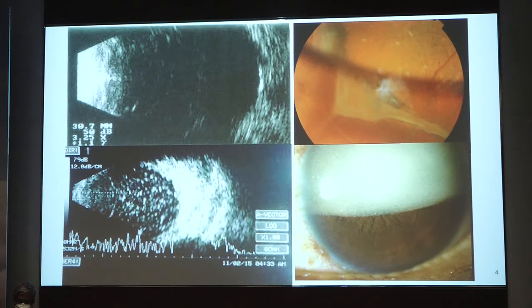Your patient may have an eye like the last one shown here, with the anterior chamber filled with the hyperoleon and a mature cataract, and your burden is increased further if he has been operated elsewhere and you do not know the viscosity of the oil that has been put in the eye.